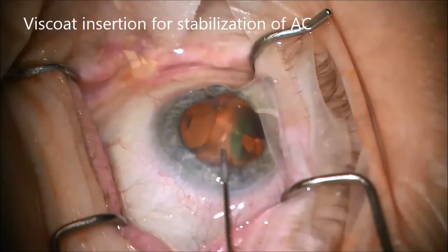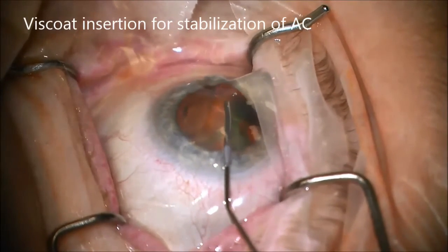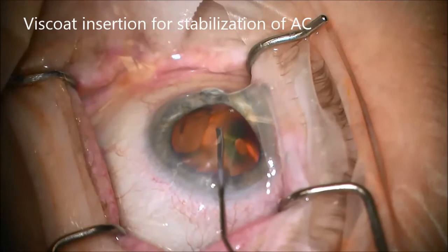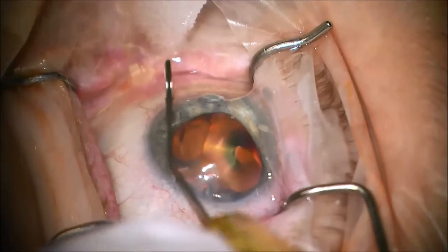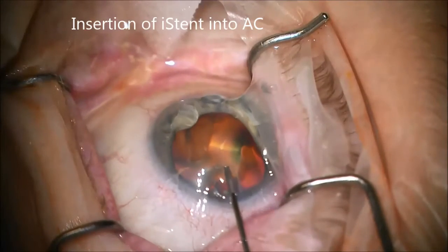I then place viscoelastic into the anterior chamber, which causes stabilization and maintenance of eye pressure and thus an improved view without corneal striae nor excessive bleeding.